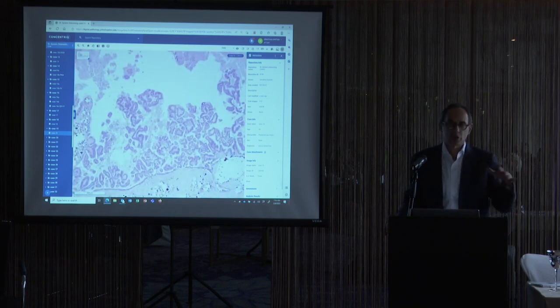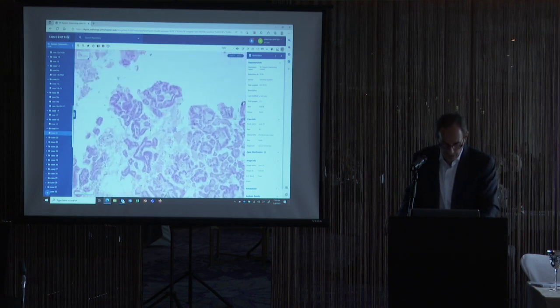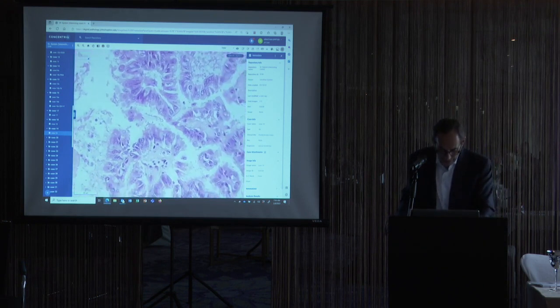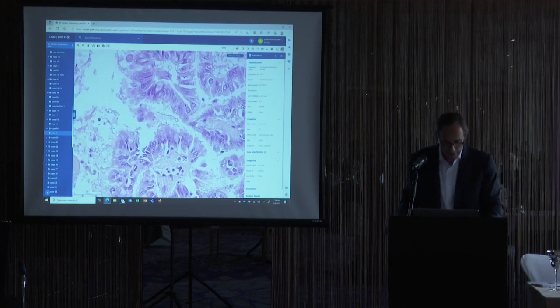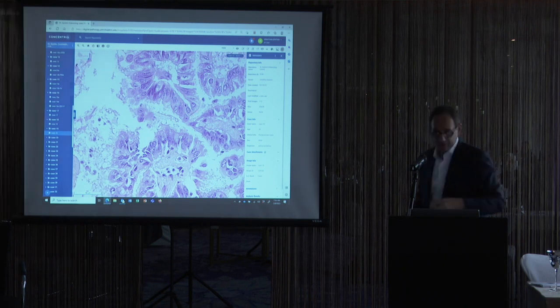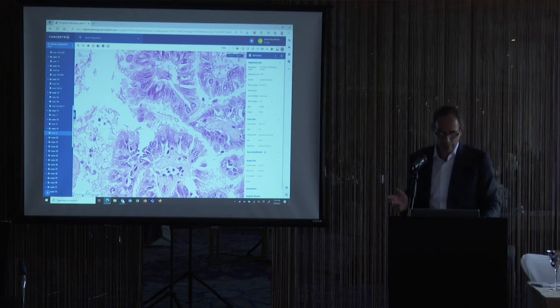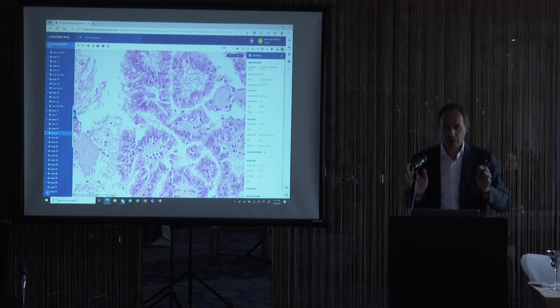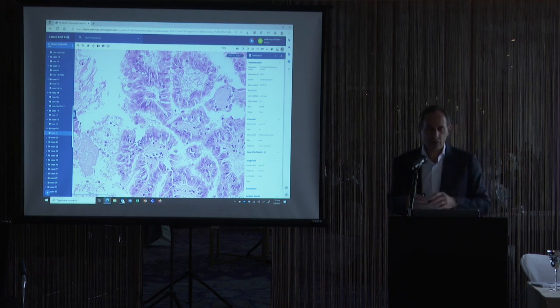Germ cell tumors only occur in the testis. And when you look at this, it's a very papillary lesion. When you look at a little higher power, there's actually cilia in all of these little structures. So what is a ciliated, cytologically atypical papillary lesion doing next to the testis? When you think of lesions that occur paratesticular, one general category you have to consider is Mullerian.